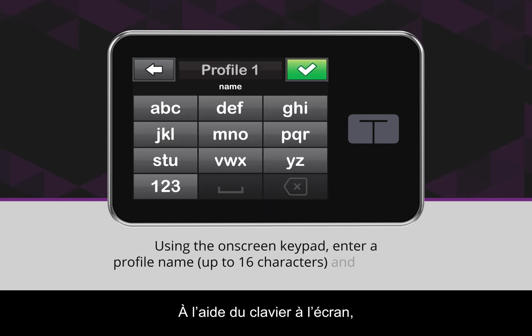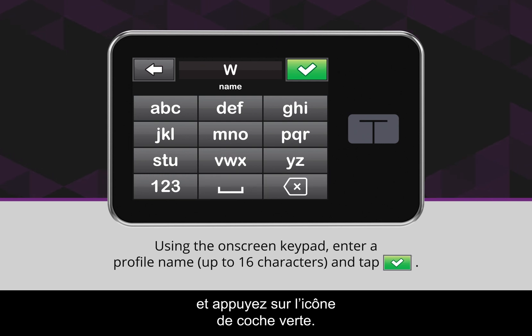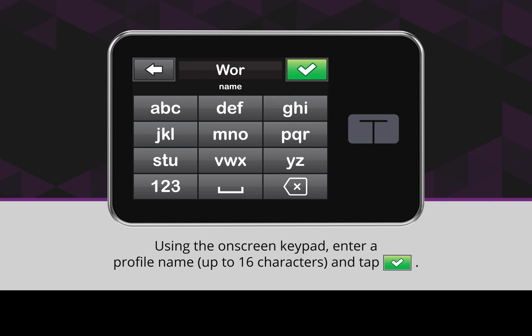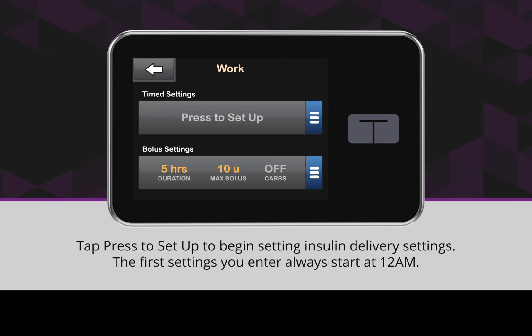Using the on-screen keypad, enter a profile name up to 16 characters and tap the green checkmark icon. Tap Press to Set Up to begin setting insulin delivery settings.